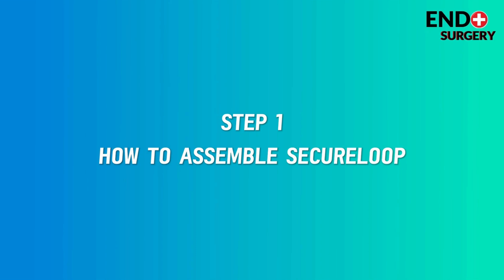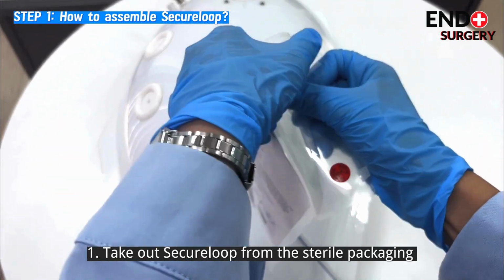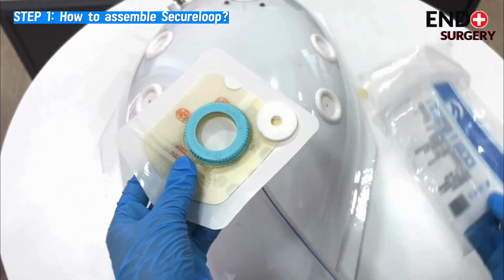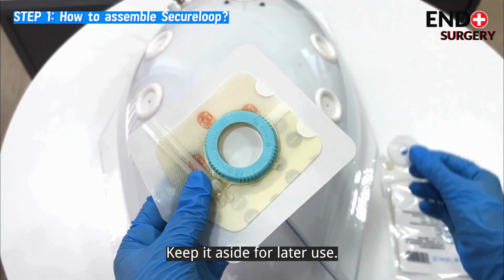To assemble SecureLoop, take out SecureLoop from the sterile packaging. There is an absorbent pad. Keep it aside for later use.